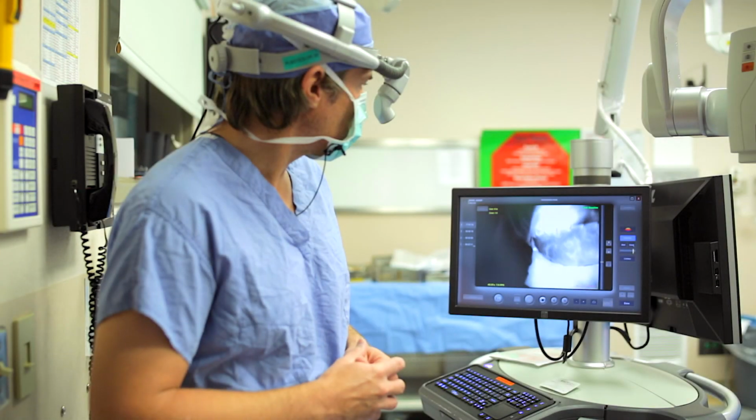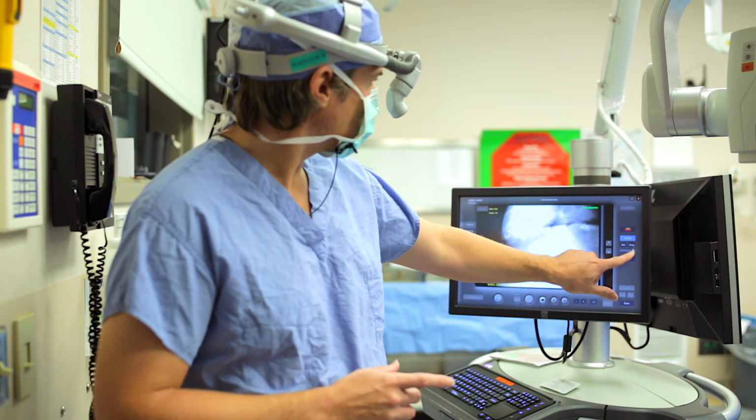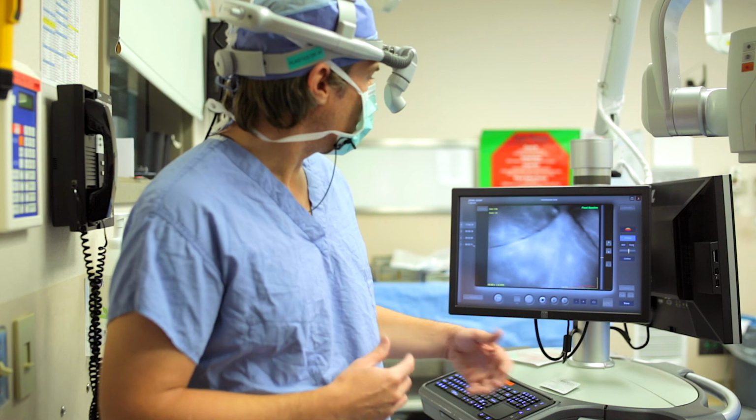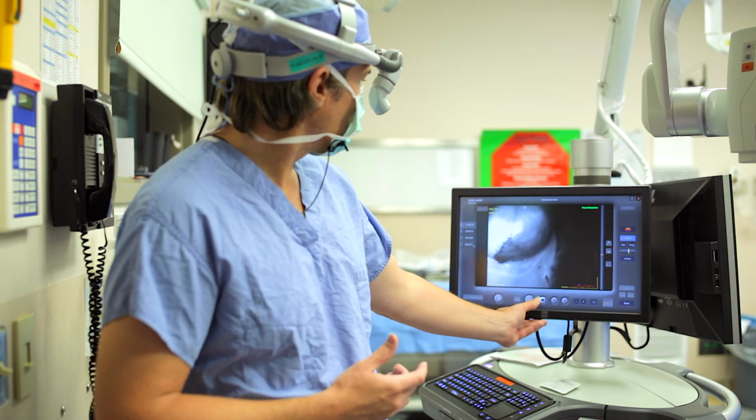Sometimes you get in this corner, you can see the mastectomy scars here and the mastectomy skin here. Nipple-areolar complex perfusion very well. Again, from previous nipple-sparing mastectomy and flap surgery. Occasionally around the corners, like you see in this corner, you get what I call the disco ball effect, okay? And again, along this lateral corner.